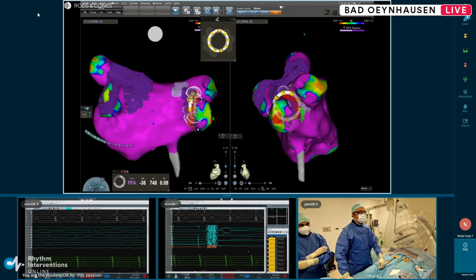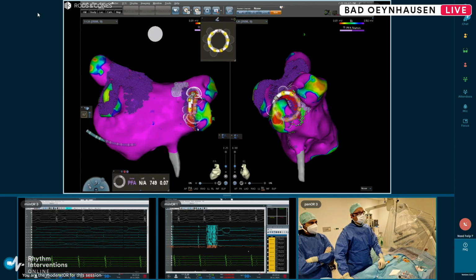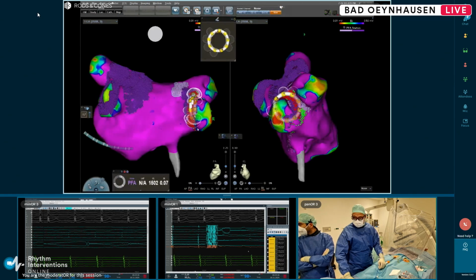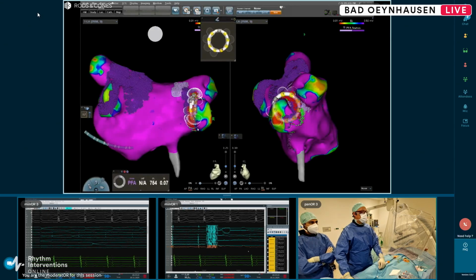Look again, please, at the electrodes, and Herr Atem, yeah, he said it's overlapping, and therefore look now at the bullseye. He deactivated electrode 1 and 10, and I hope that now we can ablate. We cannot, but we will open the catheter a bit more. Okay, try again. Now it works.